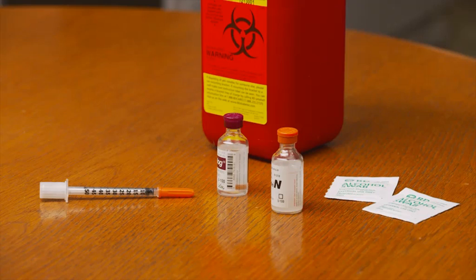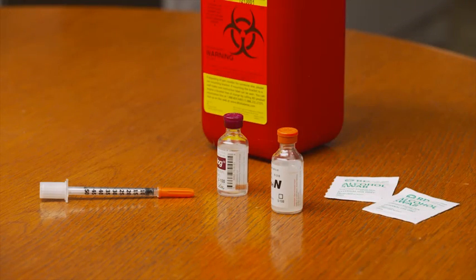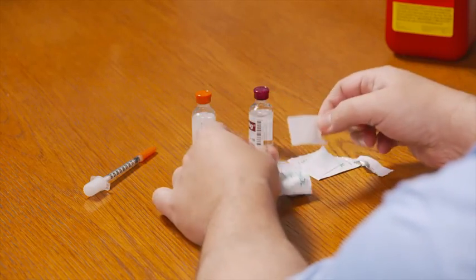First, gather all your supplies onto a flat surface. You'll need your syringe, the bottles of clear and cloudy insulin, two alcohol swabs, and a sharps container. After washing your hands with soap and water, open the alcohol swabs and place them on top of the packages.